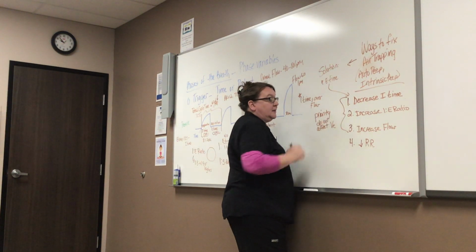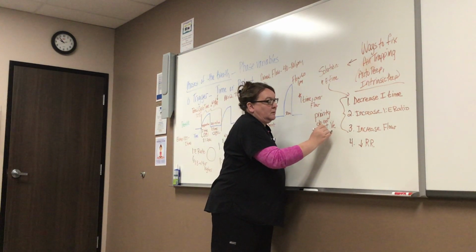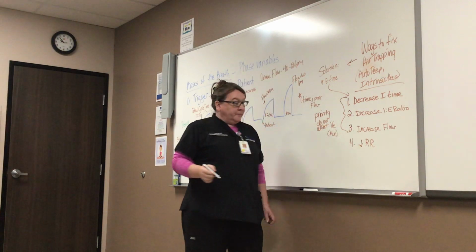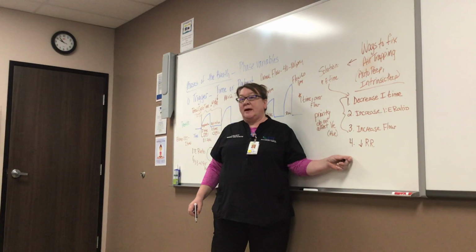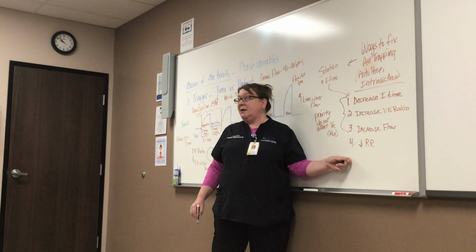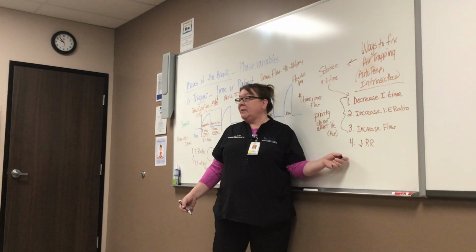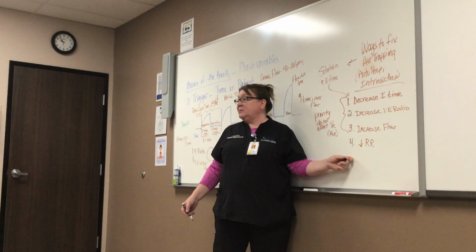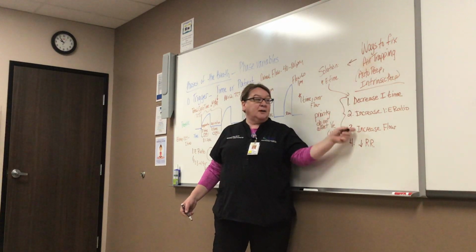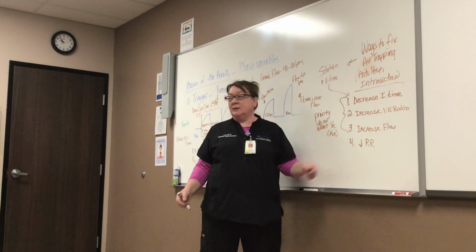Which is abbreviated VE, so get used to that one. Or MVE, sometimes you'll see it. This affects your minute ventilation. Remember, super important in this class, you have to know what makes up minute ventilation: tidal volume and rate. So if you mess with the tidal volume or the rate, you mess with your patient's minute ventilation. If you mean to, that's fine, but if my patient has good ABGs, then I don't want to mess with their minute ventilation if I don't have to, so I'm going to try to do it a different way. So that's your last resort.